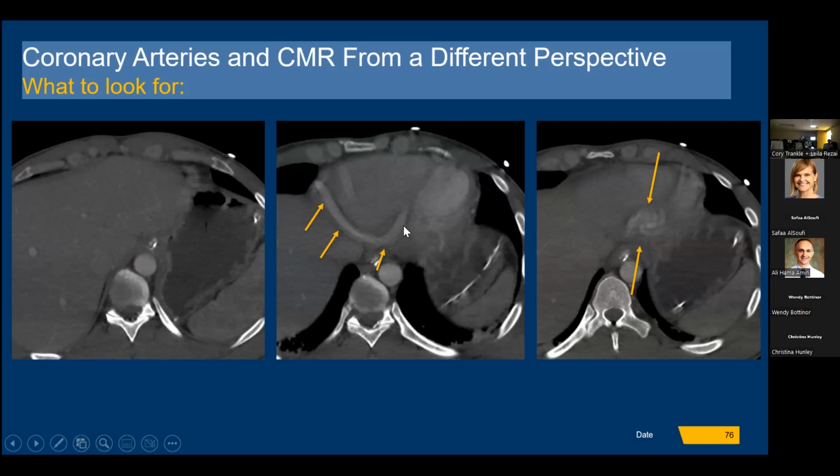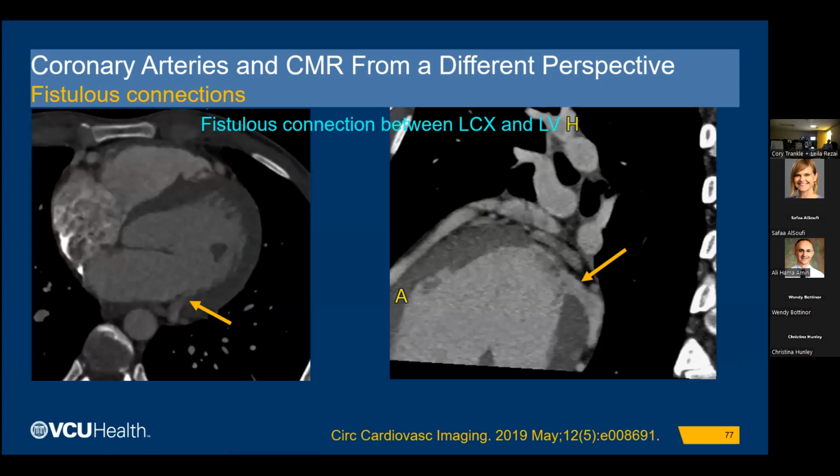They're very large, rope-shaped, diffusely aneurysmal coronary arteries. We see a tangle of vessels in the subcardiac region. So it was advised that patient receives a gated CTA when he's stabilized, which happens basically.